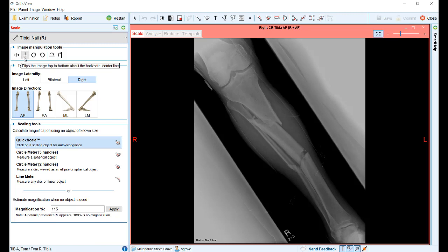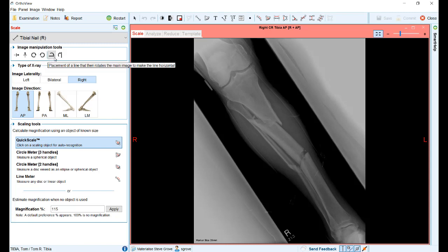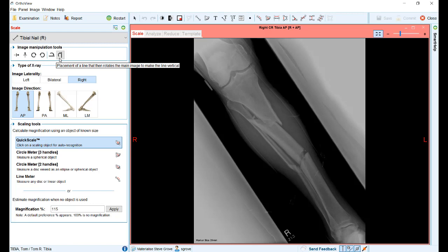As well as the original image manipulation tools, there is now the option to draw a line across the image and have the image rotated so that line becomes the true horizontal or vertical plane.